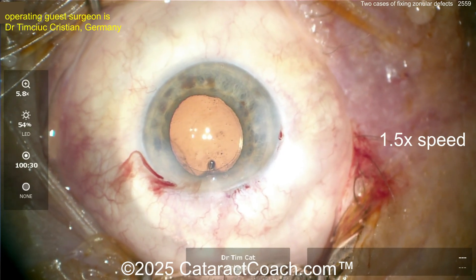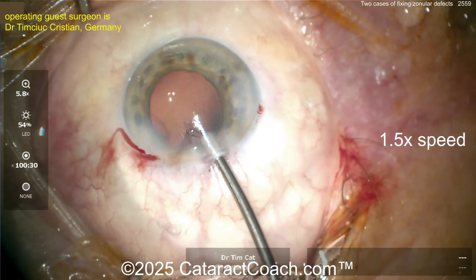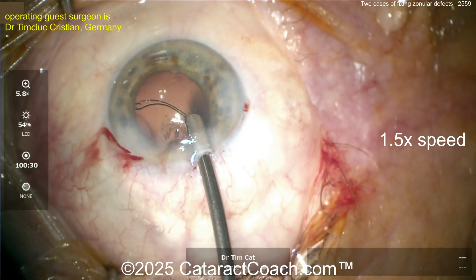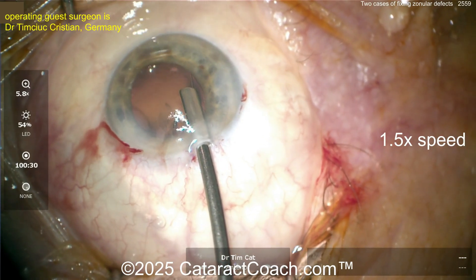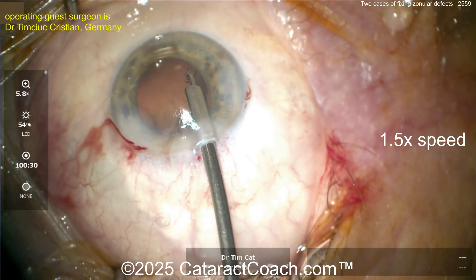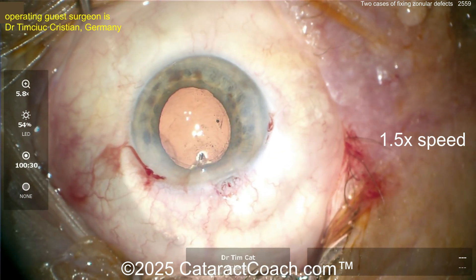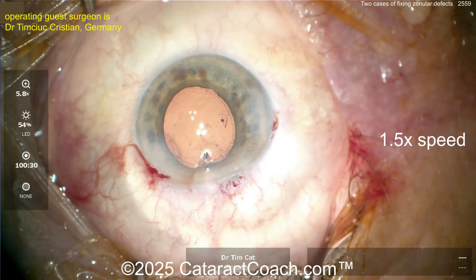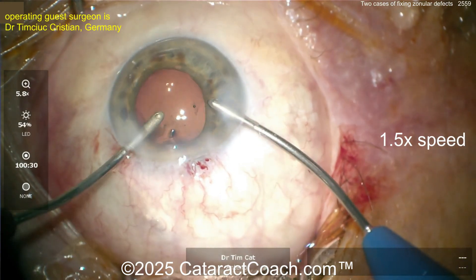When placing CTRs, I like to get the leading eyelet of the CTR with a Sinskey hook and guide it in — that's why I always orient these to the left, because my pair is going to be on the left. Putting the CTR into the capsular bag nice and easy, making sure it goes around without too much additional zonular stress. There it is — and now look, you don't have that D-shape anymore; the rhexis is back to normal, bolstered at three clock hours of weakness.